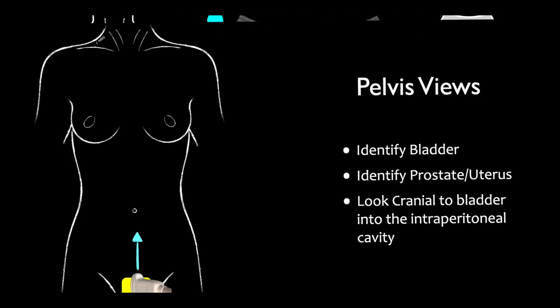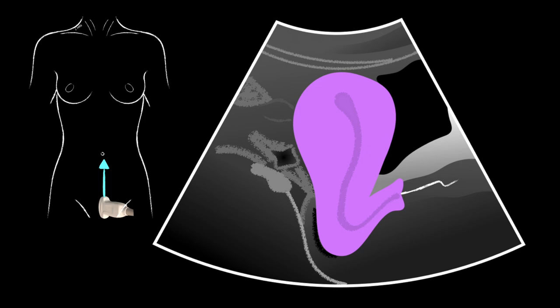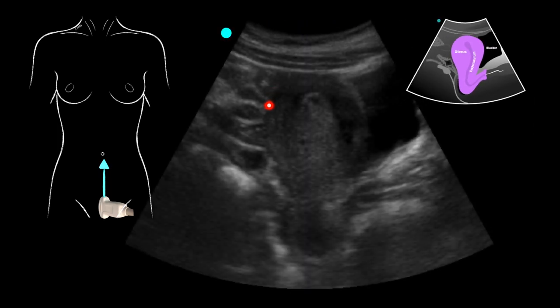In a female patient with an anteroverted or anteroflexed uterus, we're going to look for free fluid along the posterior wall of the uterus. In females of reproductive age, a small amount of free fluid can be normal if they're still ovulating. To differentiate, we cut the uterus into thirds: anything in the lower third could be physiologic and normal, but if free fluid extends into the middle to upper third, consider it pathological until proven otherwise.